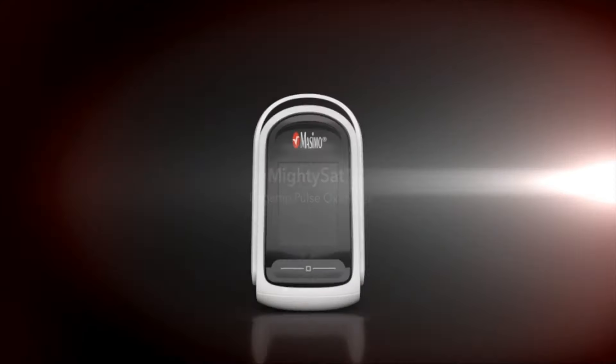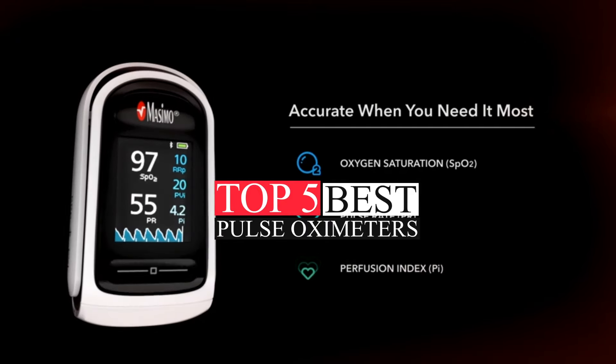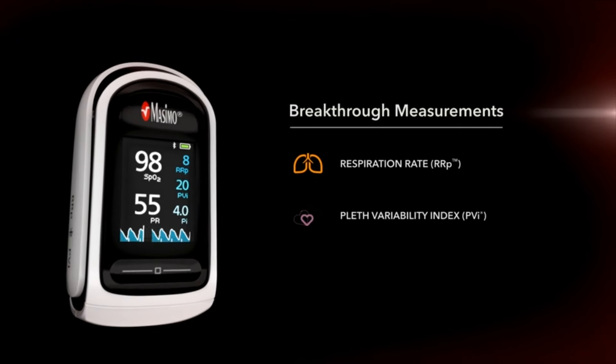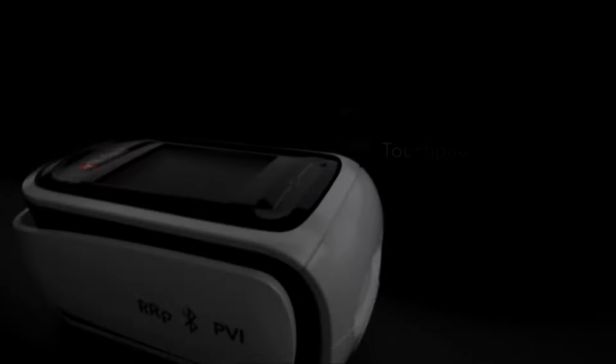Hello, wonderful viewer. This video highlights the top 5 best pulse oximeters of 2024. I've conducted in-depth research to bring you the best products on the market. From state-of-the-art features to impeccable quality, reasonable prices, and esteemed brands with user acclaim, we've covered every aspect.